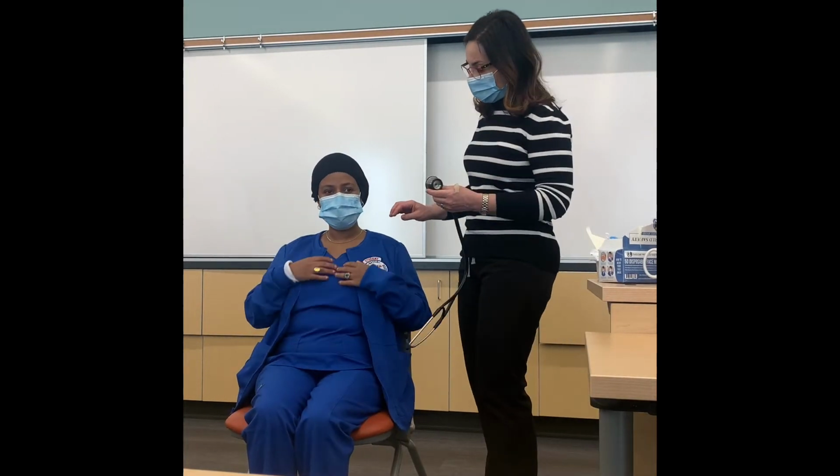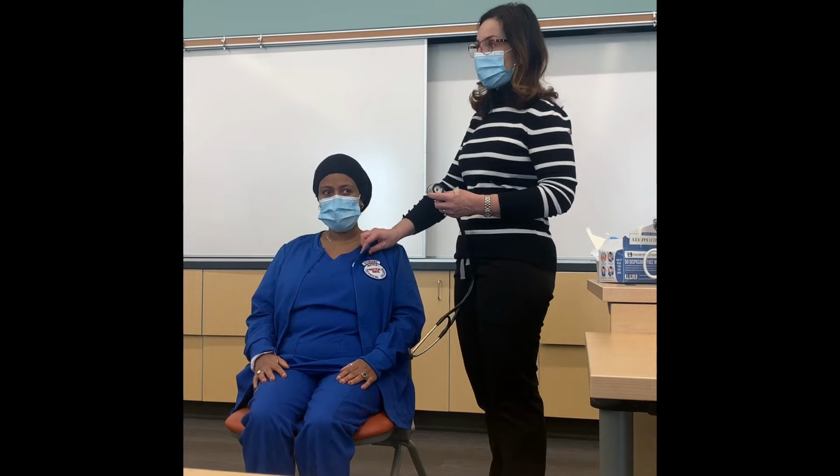I brought my stethoscope and I put it down somewhere, so give me just a second. What you want to do is put your stethoscope and you start, and I'm not gonna undress her, but know that when you're pulling the curtain and practicing with each other, give yourself as much opportunity to listen on skin. I don't wanna embarrass anybody, I don't wanna violate your privacy, any of those things. If you're comfortable with the front, great. Whatever you're comfortable with, just know that that's really the best way to listen.